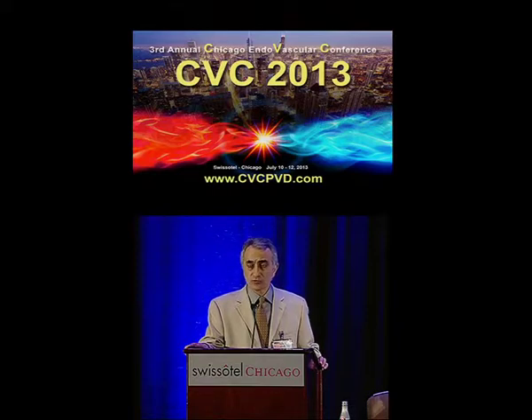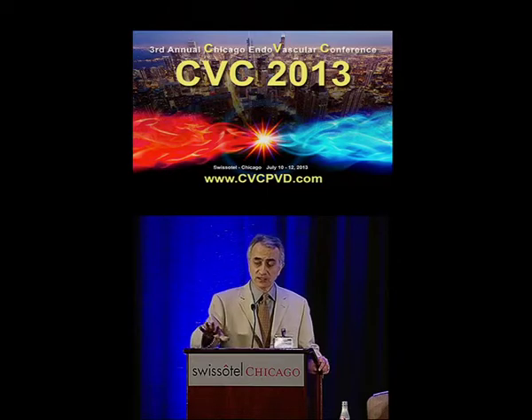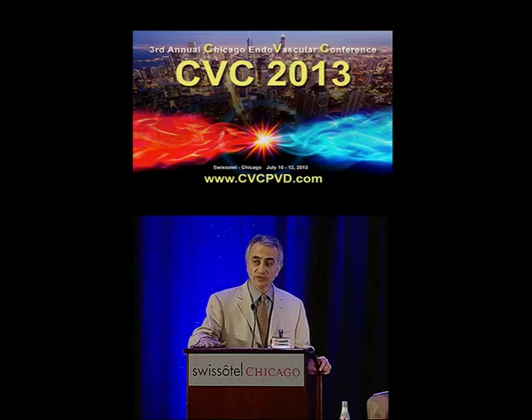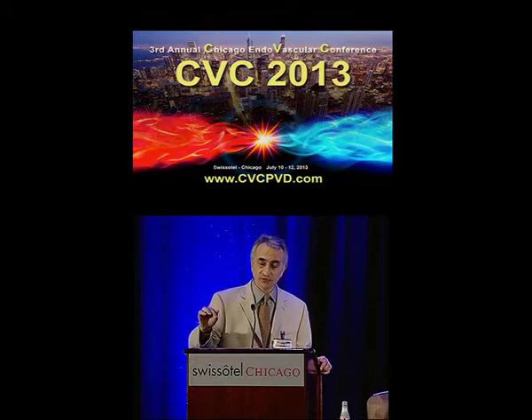Sure. So the comment is about disappointment with the outcome of stents in dialysis-related cases, and also extension of a stent across the thoracic outlet. Obviously we don't do that. The only time I stent across the thoracic outlet in dialysis patients is if that is considered to be the culprit for access failure, and you have to get patency. If you angioplasty that and before your eyes it closes, you have to do something.